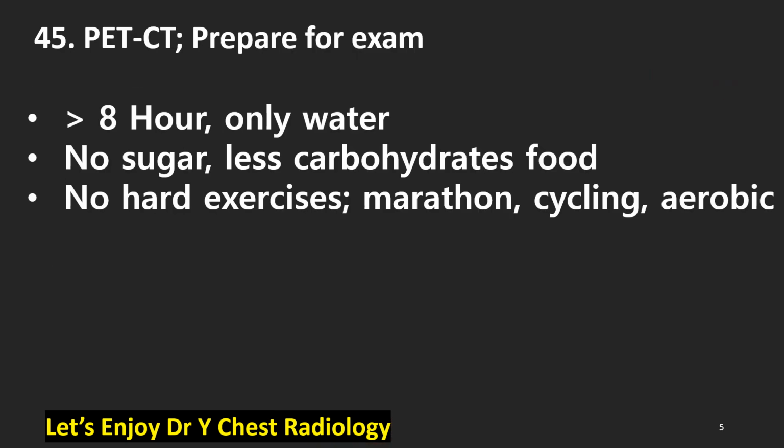Interesting. Preparation for the exam of the patients. At least 8 hours of only water drinking, no food, no sugar, and less carbohydrate food. No hard exercises such as marathon, cycling, aerobic, or swimming.